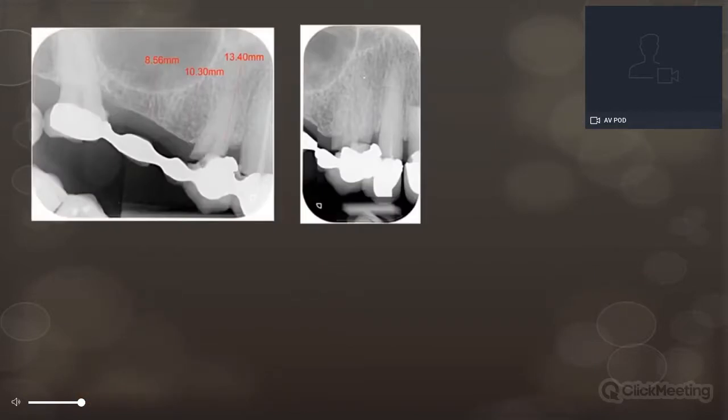But one of the things we do know from the 2D x-ray is that we will most likely need a sinus graft or a sinus lift in this specific case. What we can't see is the third dimension, which shows the horizontal component of the bone and what we would be faced with surgically, and how we would be able to perhaps consider avoiding an undercut or a big buccal deficiency, for example, angulating the implant differently. We would have to raise a big flap.